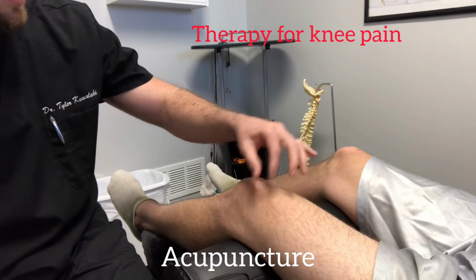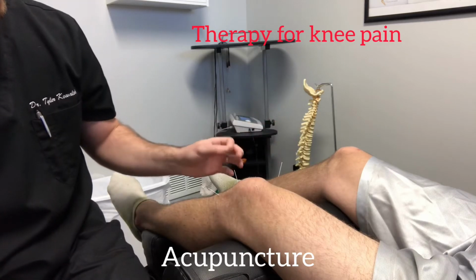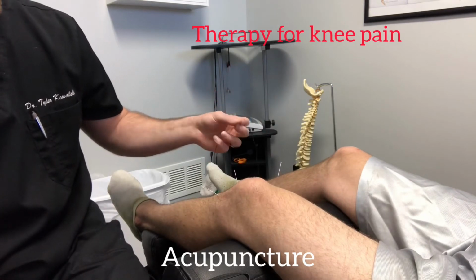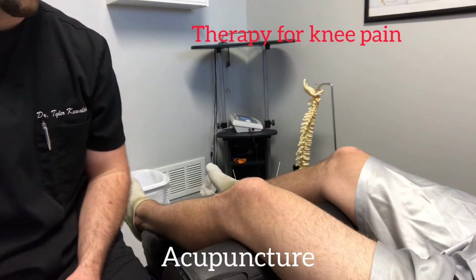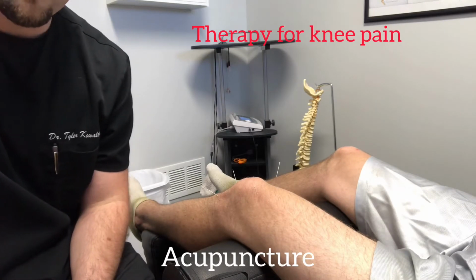If we were doing more of a dry needling session, if there was like a tight muscle, or we wanted to run a little electricity through, we have these things we'd kind of attach to the needles, and kind of like the electrical stimulation patches, we'd slowly turn it up, run the electricity through it, and could help with the knee pain as well. So there's a quick example of acupuncture treatment for your knee pain.